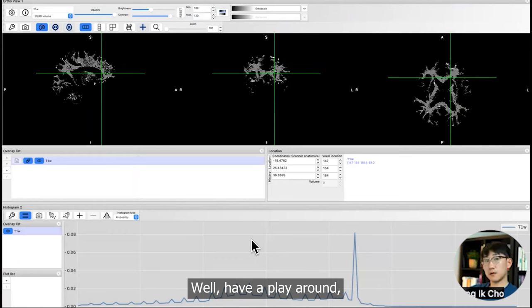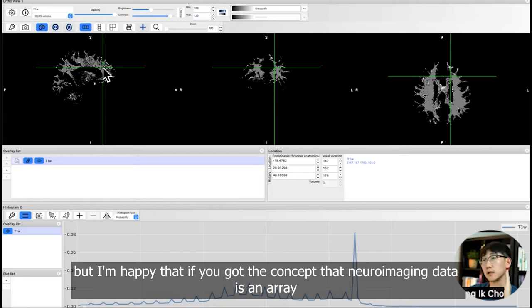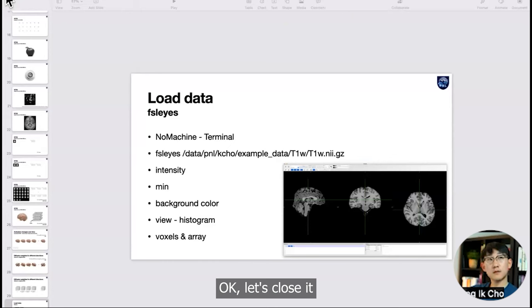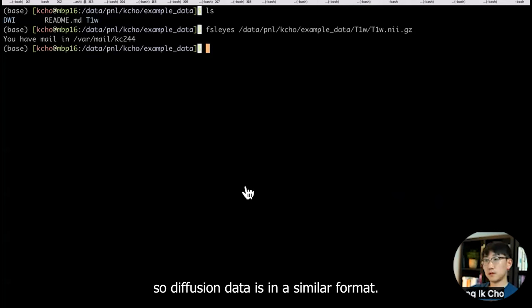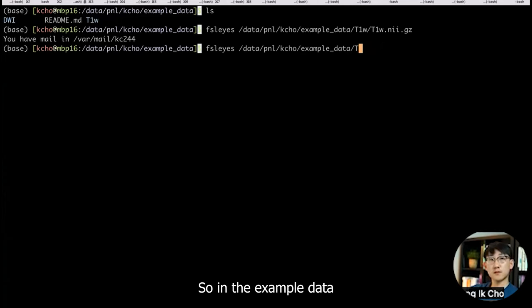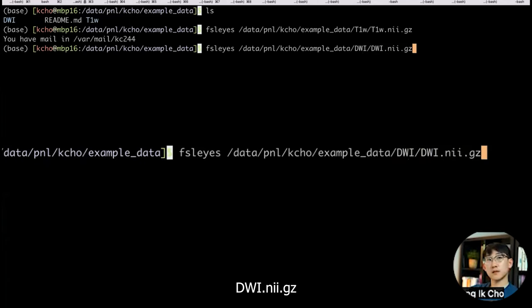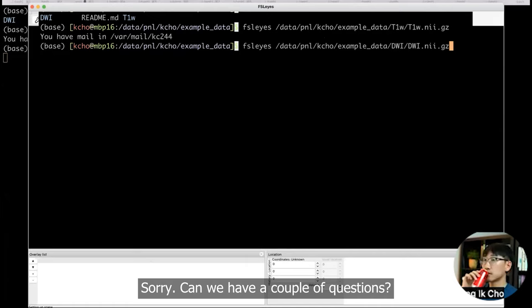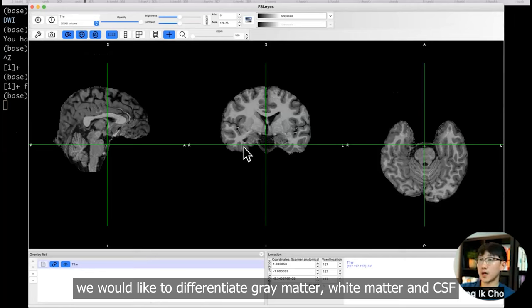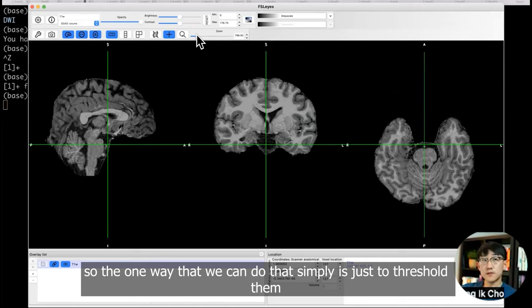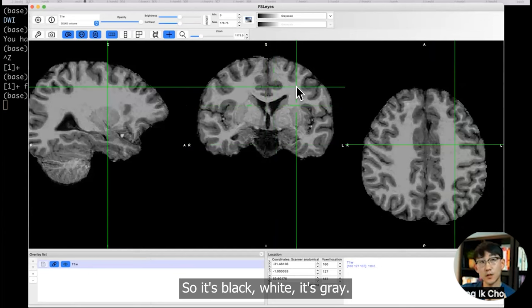Let's close it. I'm going to open diffusion data. The diffusion data is in a similar format. It's in the example data as diffusion DWI DWI.nii.gz. You can open it the same way as you open T1. Sorry, I have a couple questions. I was wondering what the histogram represents.